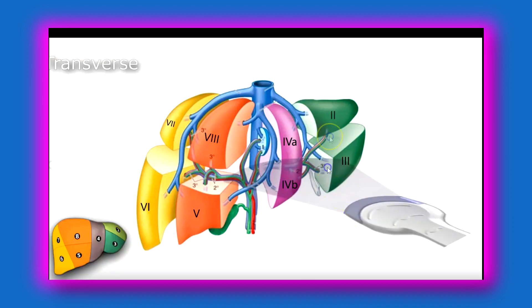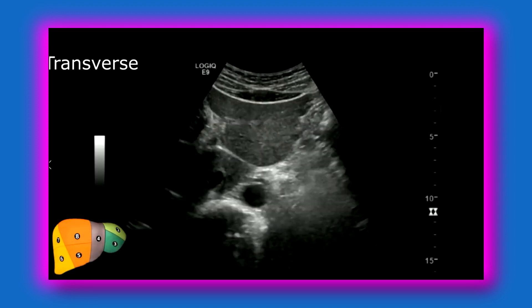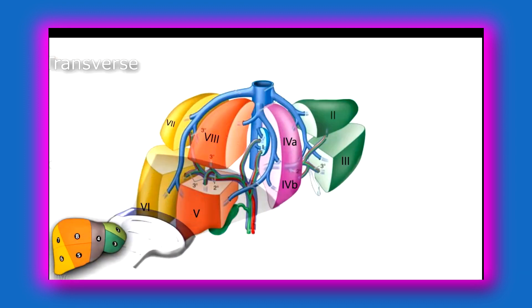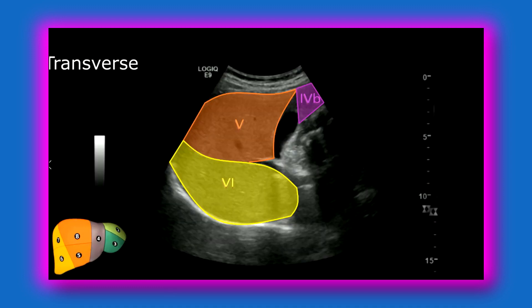Now we're going to approach from inferior to superior. There you can see the pancreas, angling upwards. Here we have segment 3, caudate lobe, segment 5, and 4B — we're around this region right here. Now scanning on the right lobe of the liver in transverse, we've got your gallbladder, segment 4B, 5, and 6 — right here, 4B, 5, and 6.